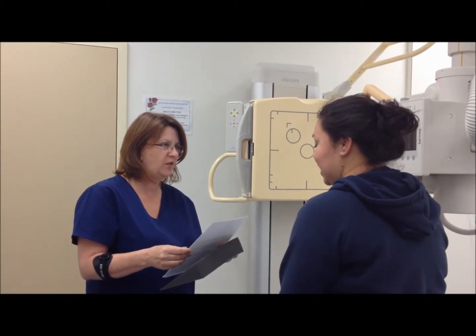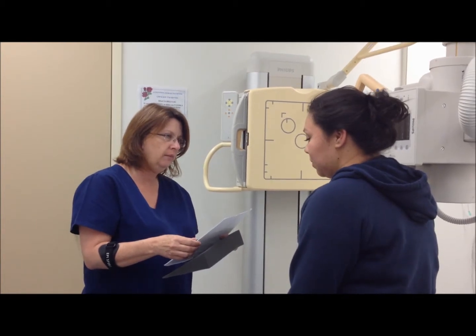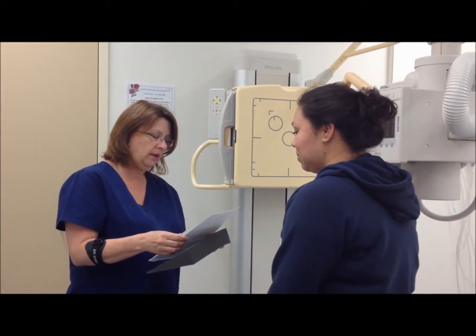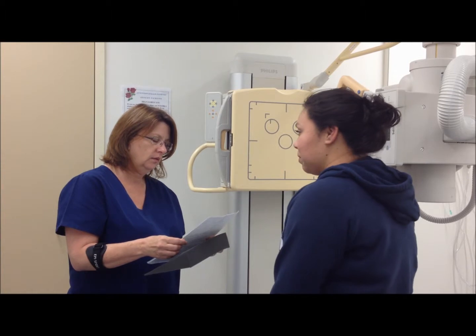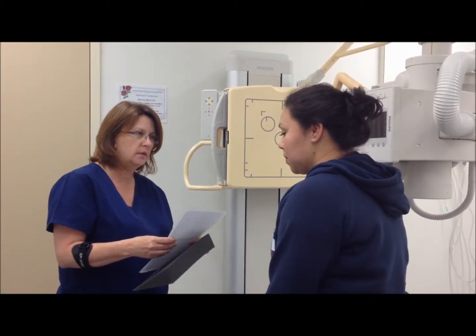Smith. My name is Fran. I'm going to be doing your sinus x-rays today. Can you tell me your first name? Maribel. And your birthday? 3/1985. So the doctor's ordering some sinus x-rays. You're having some sinus infections?